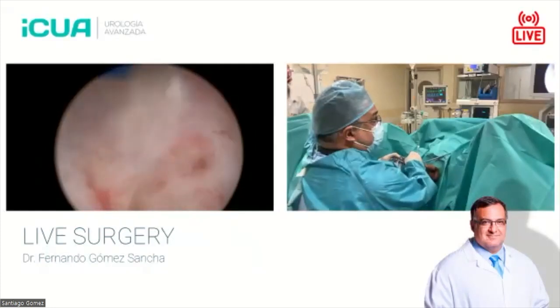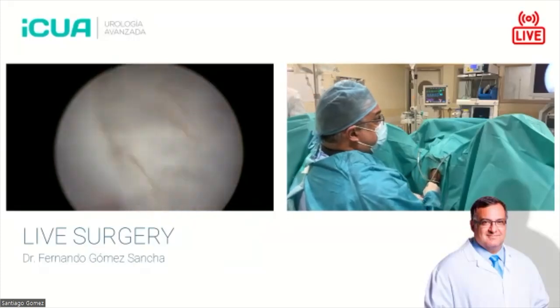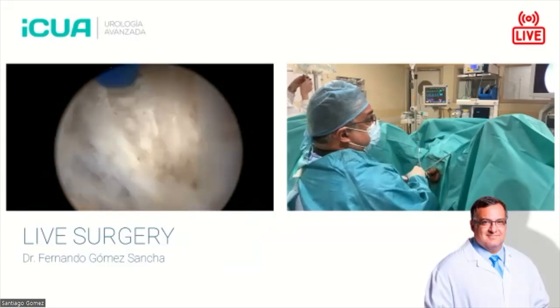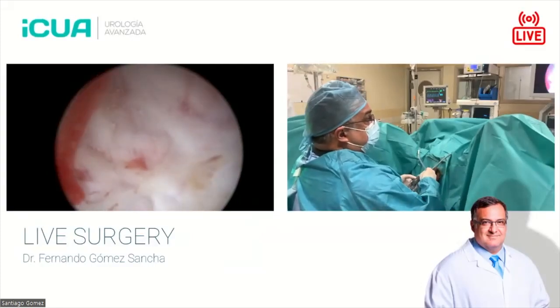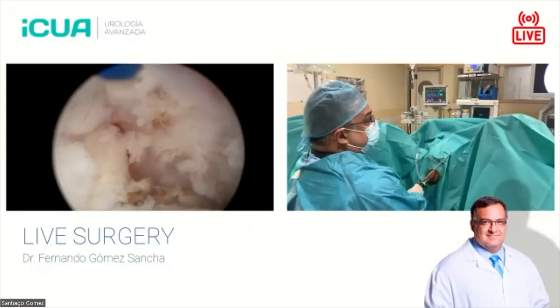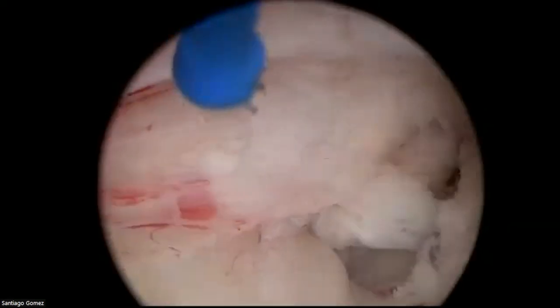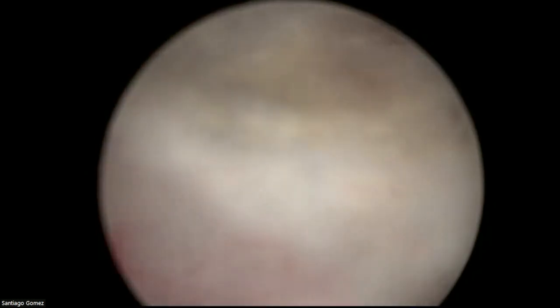I used to work with Richard Wolf instruments, and what I like from them is that the tip is not aggressive, so it's not pointy. And also the lens is a little bit inside the tip. So even when I touch the tissue, now I am touching the tissue, I can see what's happening. With Storz, for example, you get a situation where, you see, these are nodules. We want to take these nodules out. So I need to go further up here. So I prefer these instruments because of this particular situation.